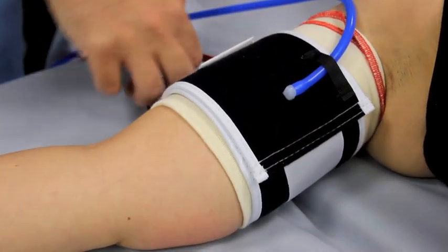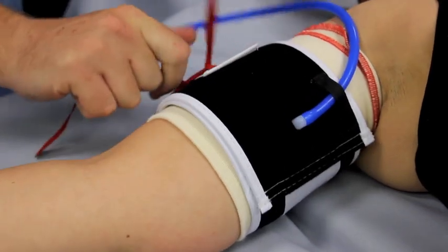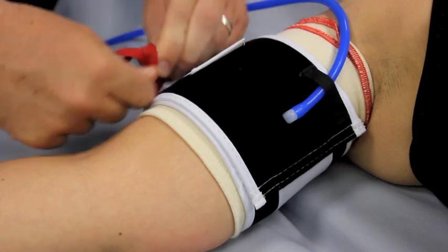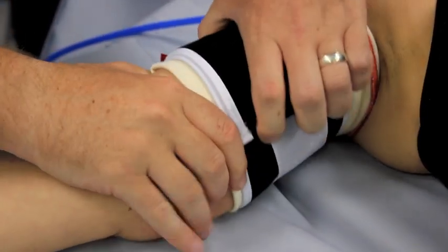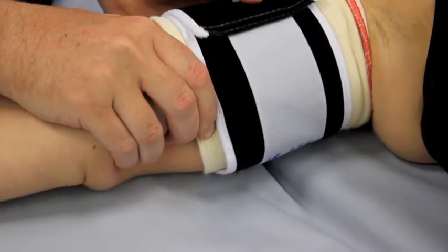In this video, a straight arm cuff is used, however, the conical cuff is designed to fit optimally on patients, particularly those with muscular or pear-shaped thighs.